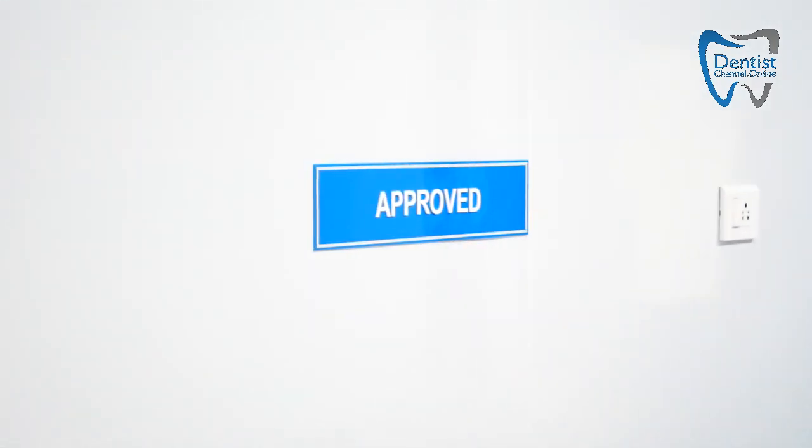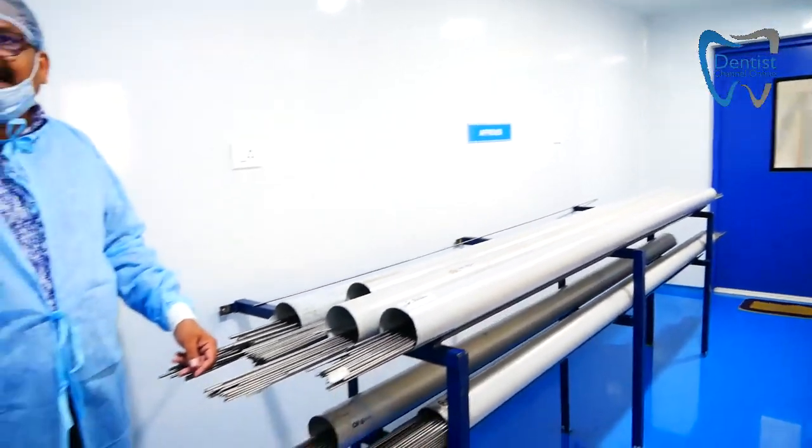When the raw materials arrive, the supplier provides a certificate compliant with the American Society for Testing and Materials. Implant raw materials come in as ASTM F-136 grade titanium, and the supplier provides the F-136 certificate.